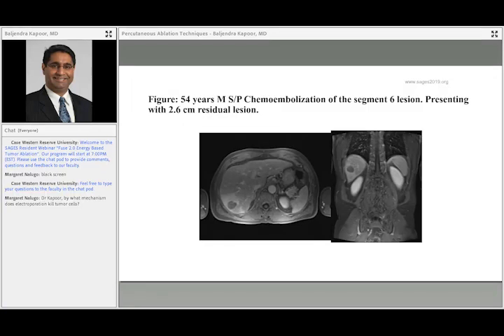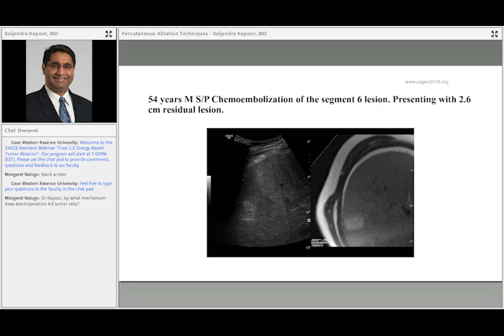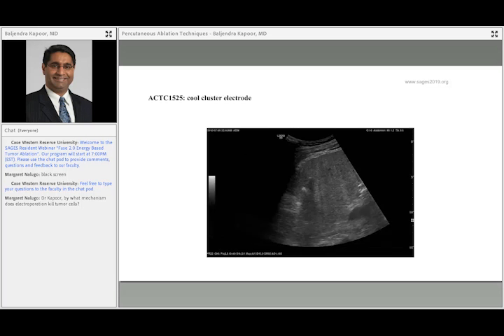And here is another case. It's a 54-year-old male, status post chemoembolization of a segment 6 lesion, who presented with a 2.6 centimeter residual lesion right here. This lesion was well seen on MRI here. You can kind of see it on ultrasound, but you do see some rib shadow along with it because it's quite peripheral. So I decided to go ahead and ablate this residual lesion.